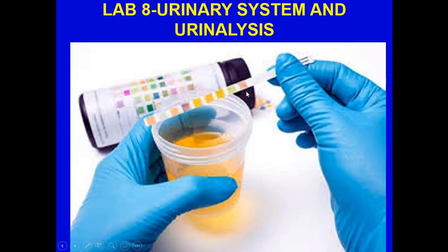Here's an individual doing the dipstick test. So they dip this into the urine sample and then read in the direction with what are each one of these. This is a different test from this, and this. So what I'm saying to you is that each of the little pads there is a specific biochemical test for the urine. And if you do it right and you time yourself right, you're going to get a lot of information very quickly.